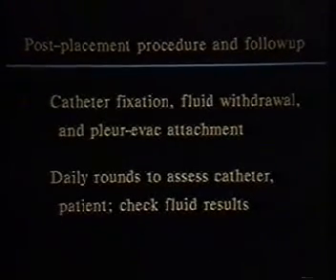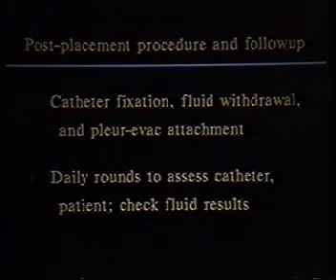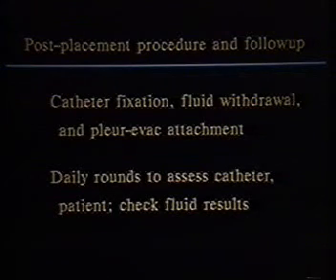After we have placed our catheters, it's very important that we fix the catheters in position in order to avoid their inadvertent removal. We attempt to then aspirate the fluid or air collection completely by hand until we get resistance or the patient develops pleuritic-type pain. We then almost always attach our catheters to a Pleurovac suction device in order to evacuate the remainder of the fluid or air in the chest.